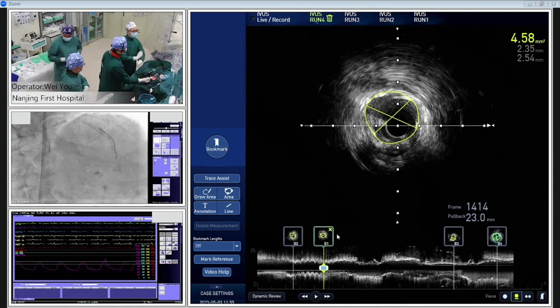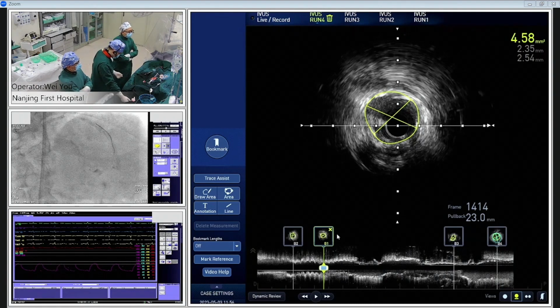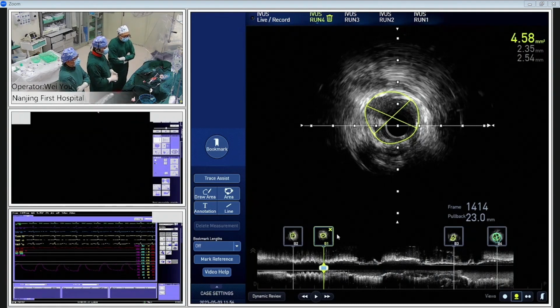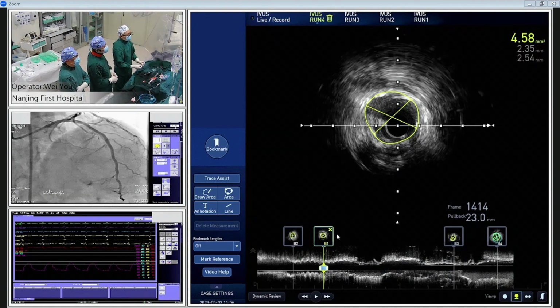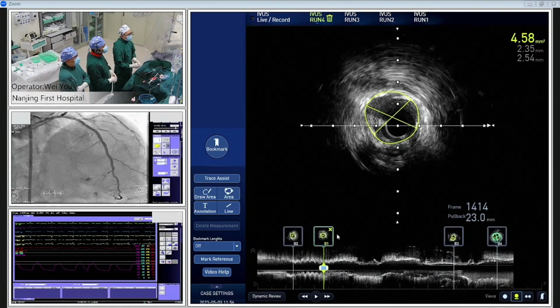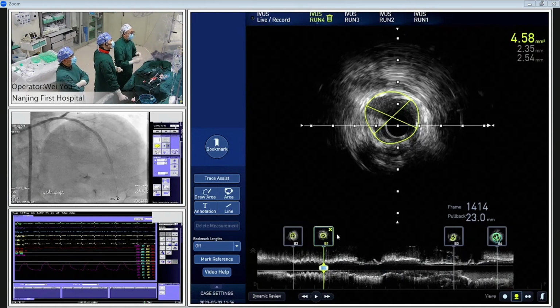Okay, thank you, Chief. Just like Professor Zhang, our chief, has told us, for big calcified lesions, lesion preparation seems very important before DES implantation. So for today's case, we used rotablation modified to let the IVL balloon pass through easily. We used the 1.5 burr. It's different from the old times when we used the big size burr to perform debulking, because nowadays we rarely use a big size burr, to avoid the incidence of complications of rotational atherectomy.